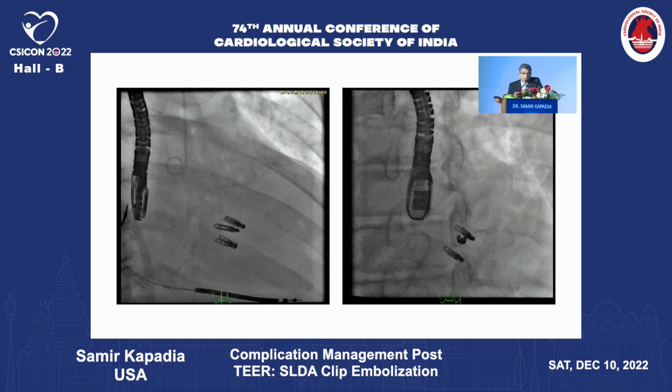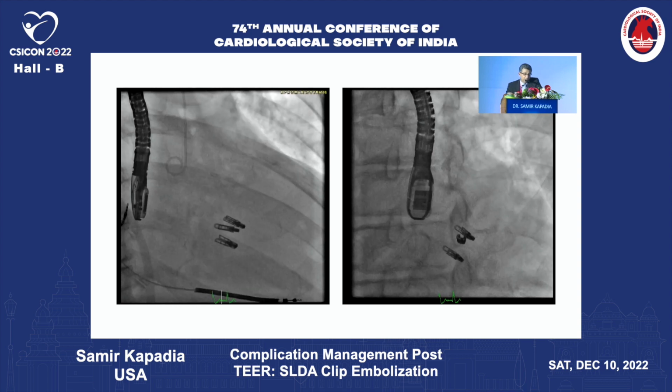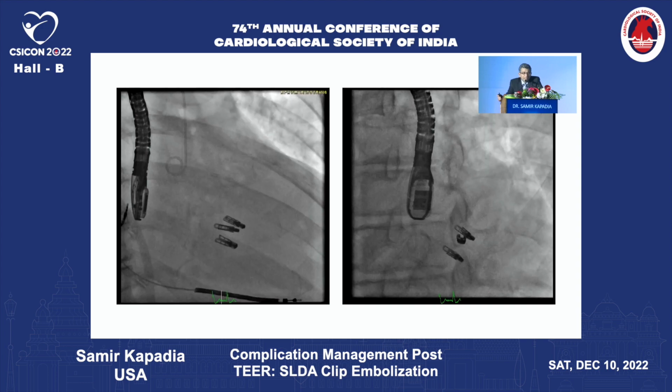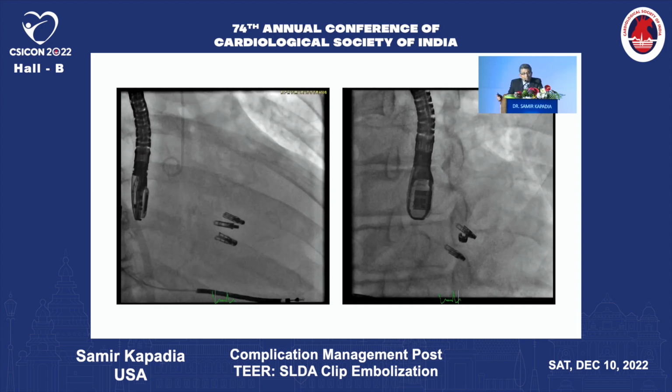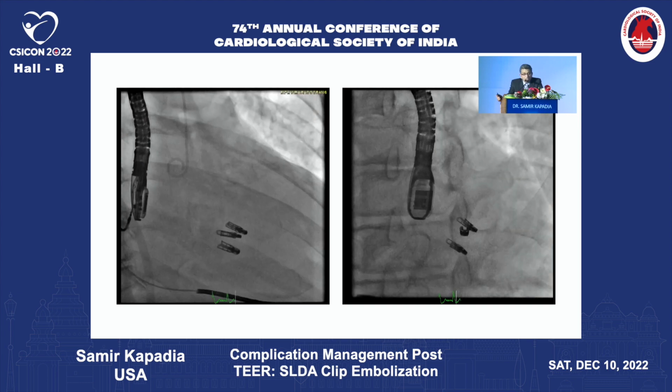You can be very, very close to the clip or slightly away. In this particular case, the medial clip is a little bit away by design because we are afraid of tearing the leaflet if you pull the leaflet too much. So this is something to keep in mind, that if the leaflet is torn, the tissue is defective, and you don't want to stretch it too much.